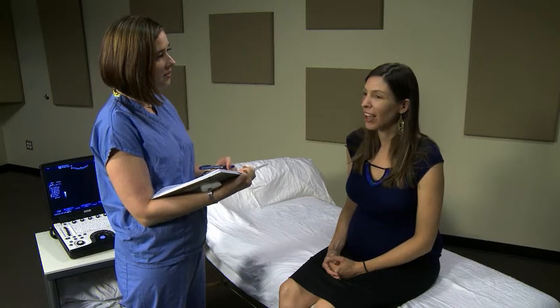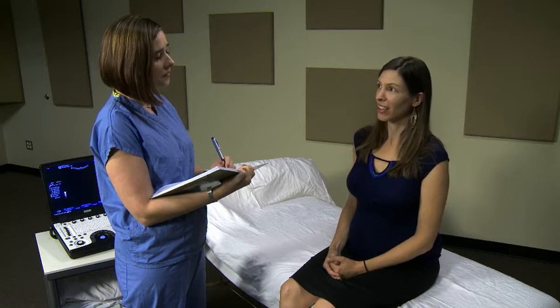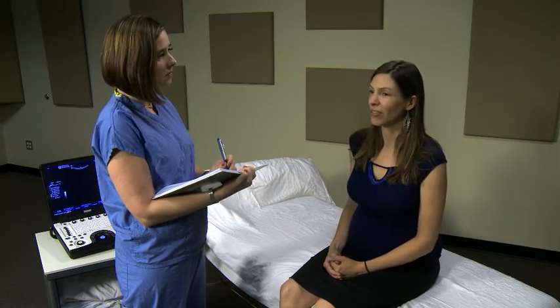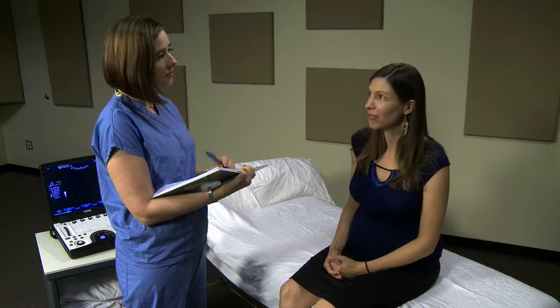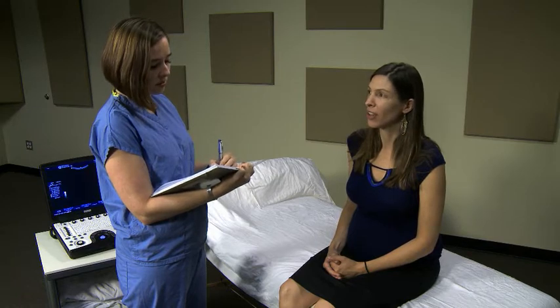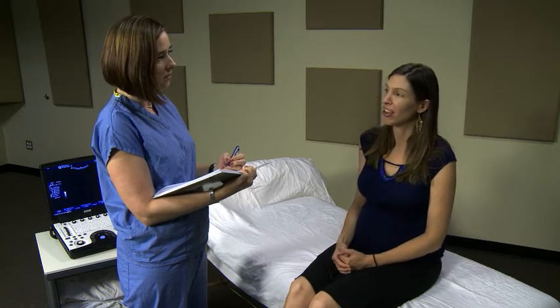Ask the patient how her pregnancy is going. Any pain or bleeding? What number pregnancy is this? Does she have any concerns about this pregnancy? At this point, it is important to tell the patient that you will not be able to tell her the gender of the baby. There are no exceptions to this rule.